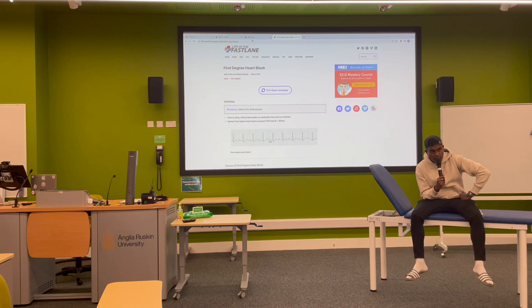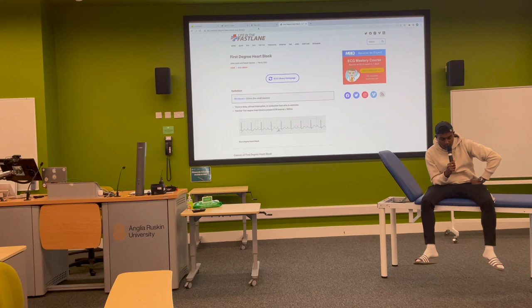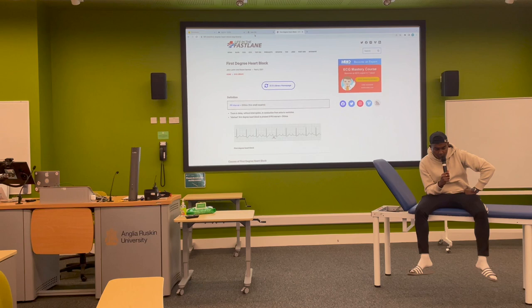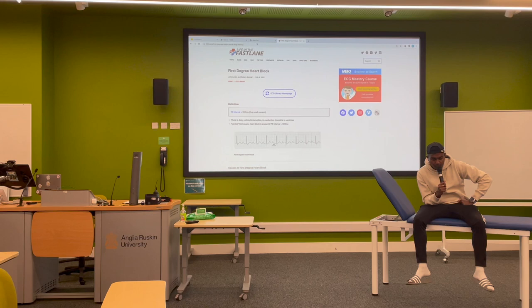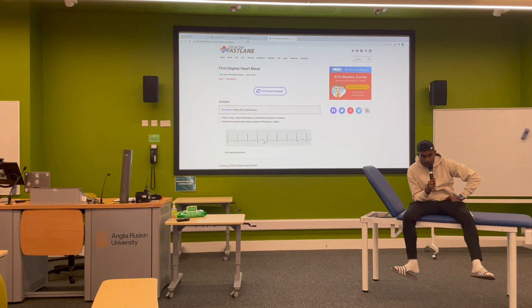Wash your hands. Introduce. Right, this is patient X, born on the 31st of March 1999, presenting with chest pain, coming to the emergency department. An ECG was taken straight away. From this ECG, I can see that the rate is regular. I'm going to check that with a piece of paper now. I would like to check the intervals. The intervals are regular. The rhythm appears normal. I can see P waves, X, Y, Z. You can just list off everything you see. But don't forget to do speed of tape. They can trick you, and it has happened before.